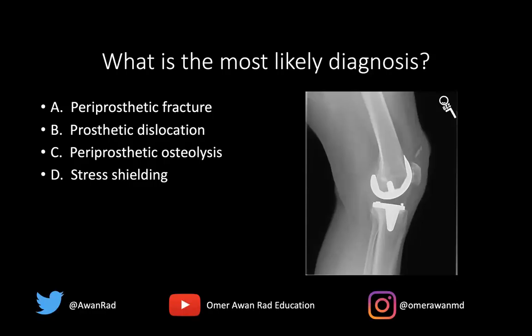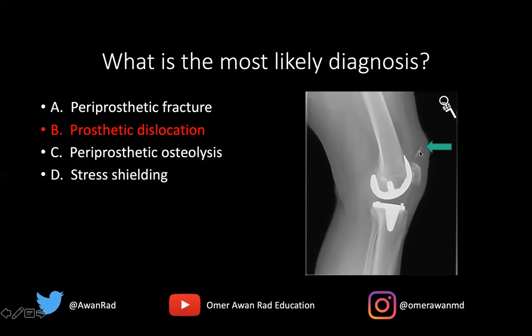The answer here, of course, is prosthetic dislocation. A total knee arthroplasty means that all three compartments of the knee have been replaced — the medial femoral tibial compartment, the lateral femoral tibial compartment, and the patellofemoral compartment. What we have here is the patellar button or patellar liner that's been displaced superiorly with respect to the patella. It should be seated on the articular surface of the patella, so this displacement represents a case of prosthetic dislocation.